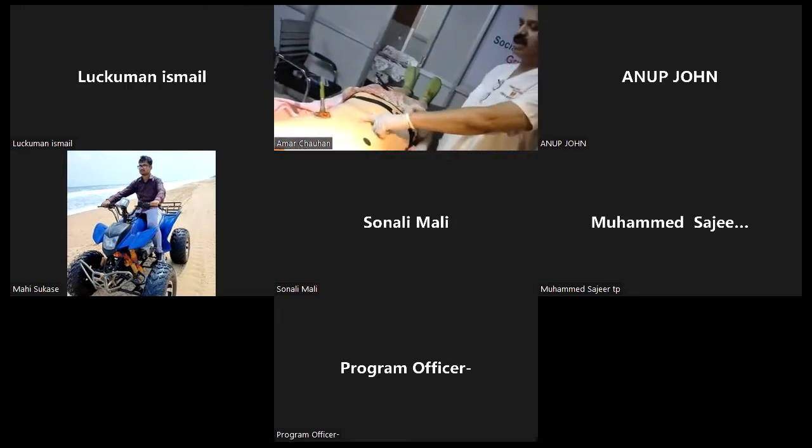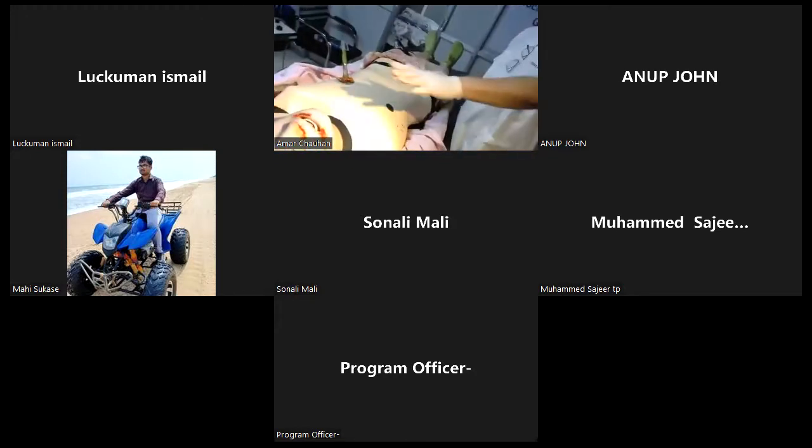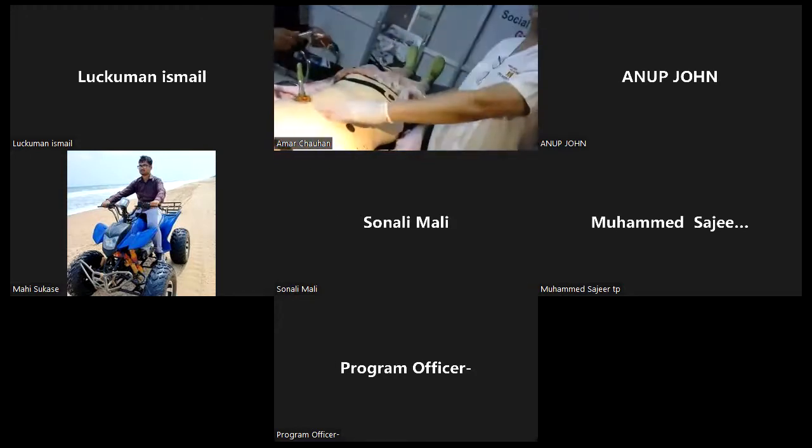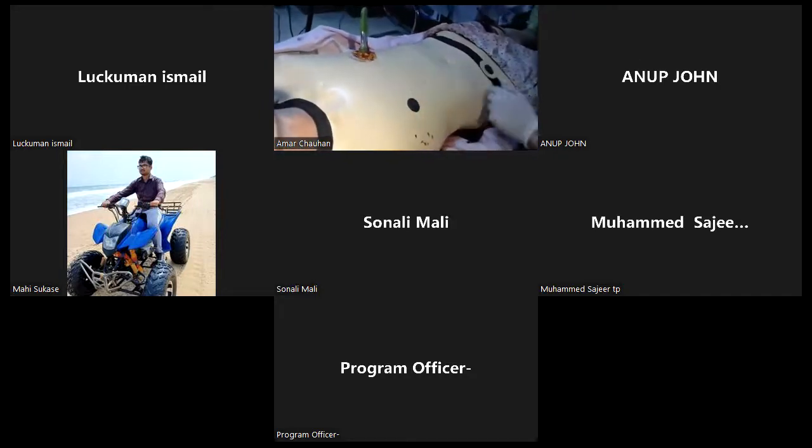And one more thing that you can do is landmark pericardiocentesis also. So I will just demonstrate pericardiocentesis in this patient. And please note that the patient is breathing spontaneously. Focus on the chest.